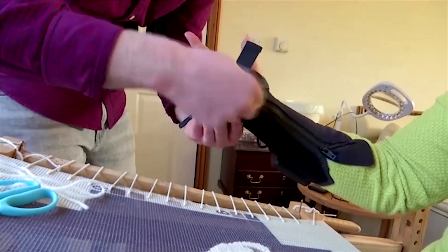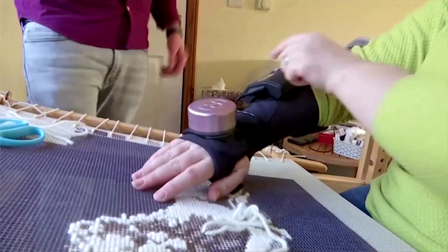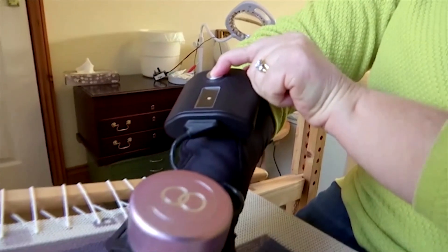Essential tremor is quite a hidden disability. You don't see how much it affects us, how our muscles hurt, the beating they take with the tremor on the move all day. As soon as you put the gyro glove on, it puts your muscles at ease. They're not under so much pressure all the time.